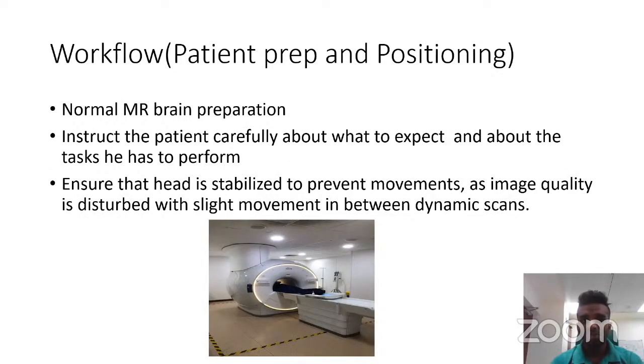And when it comes to workflow, that's patient preparation and positioning, there is not much difference, same as how we do a normal routine MRI brain, same positioning. And the important part of patient preparation is instructing the patient, because the patient is not aware of what fMRI is and what's happening in fMRI.